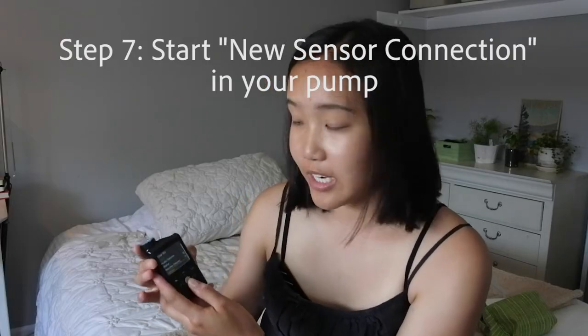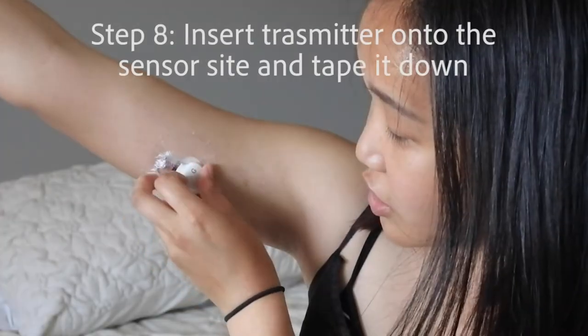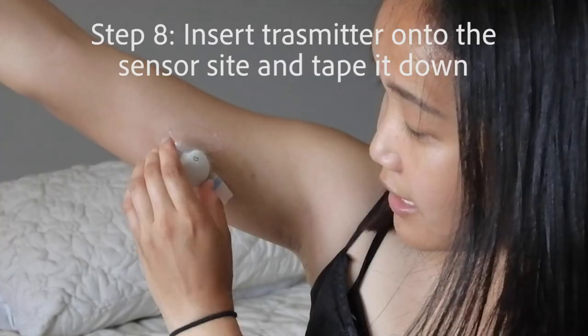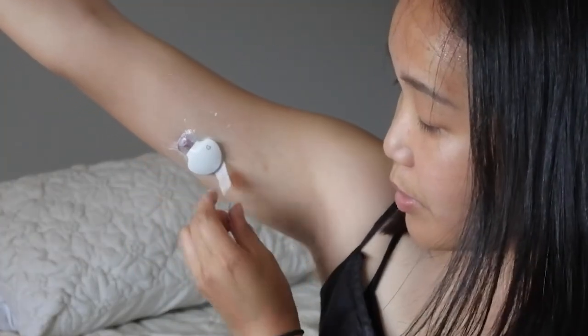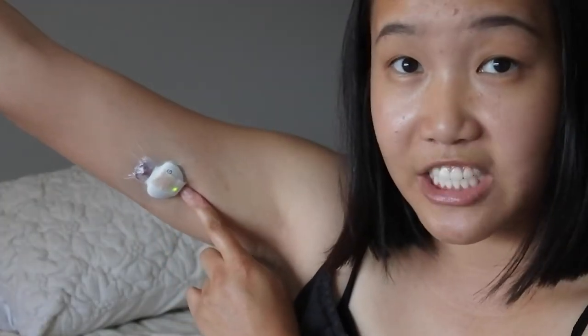After you've put down your tape, go into your pump and start a new sensor. Go to Utilities, then Sensor Settings, then Sensor Connection, Start New Sensor, and press OK. Once that happens, go back to your transmitter, take it off the charger, insert it into the sensor, and hear a little click. Then remove this piece of tape, put it on, and you should see a little green flashing light.